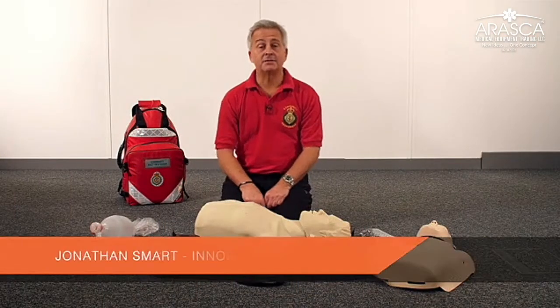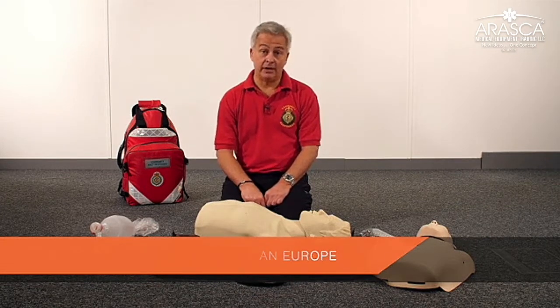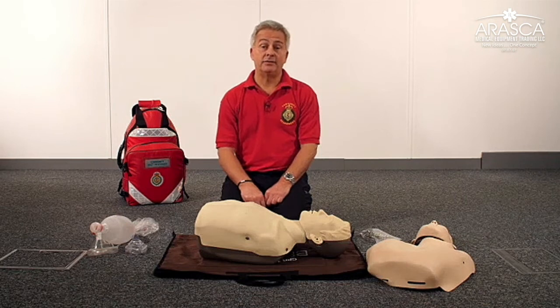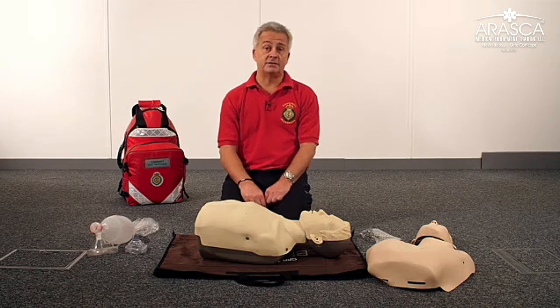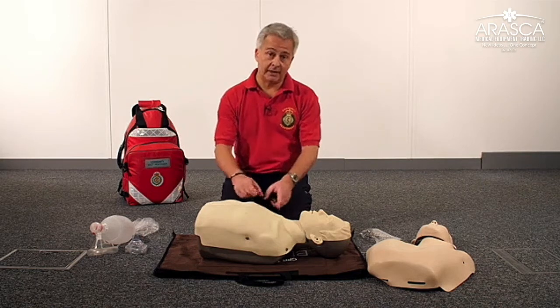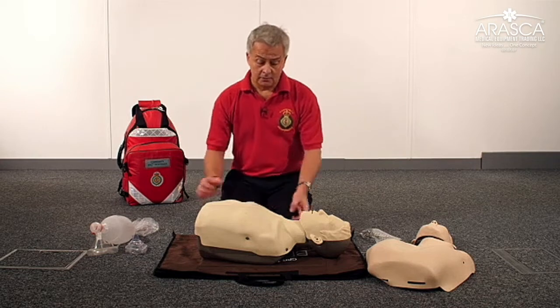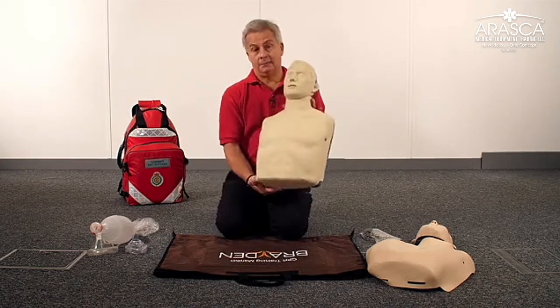Hello, my name is Jonathan Smart. I work for Innosonian in Europe, the manufacturer of the Brayden mannequin. I'm also a volunteer first responder with Southeast Coast Ambulance Service, and our group in Sevenoaks use the Brayden mannequin to teach CPR in our local community. The Brayden mannequin is obviously an adult mannequin.